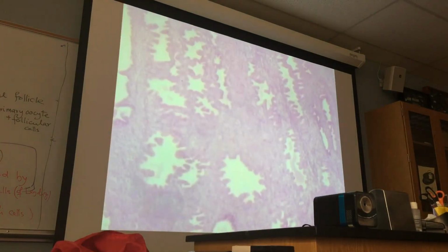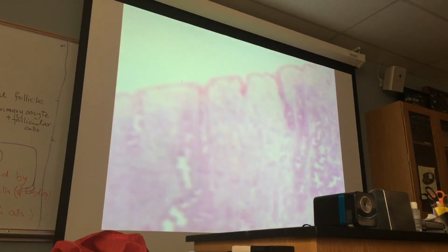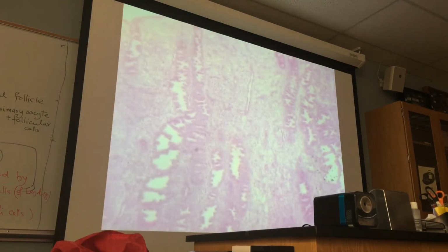Section from the uterus, meaning not from a living person. The uterus is taken out and the surgery is called hysterectomy. So after hysterectomy, the uterus was used for making slides, and that's why we have these slides with us.